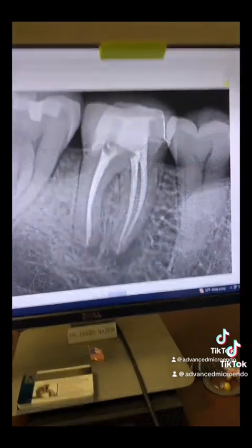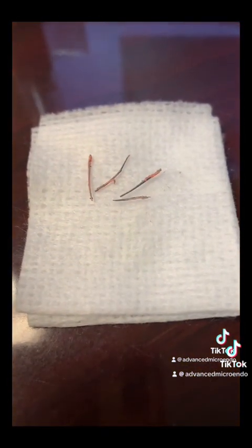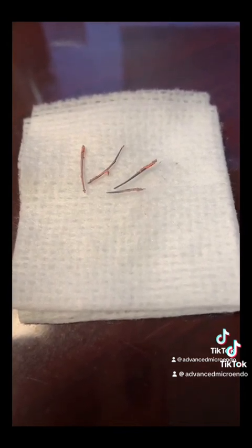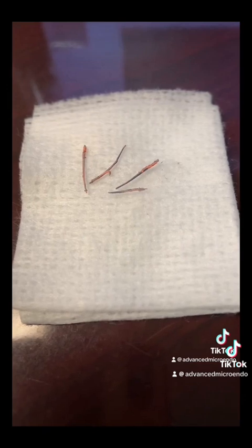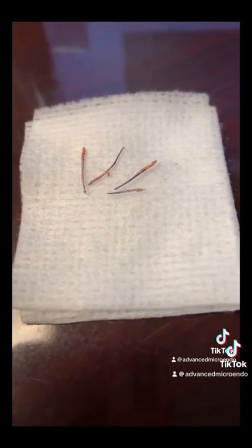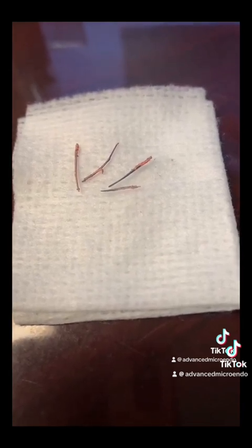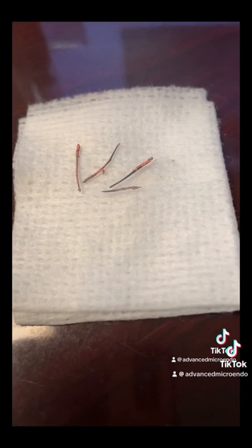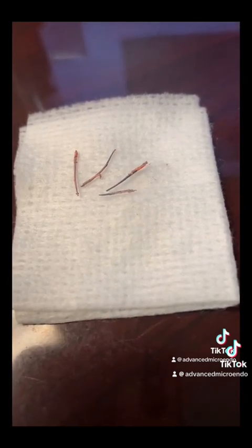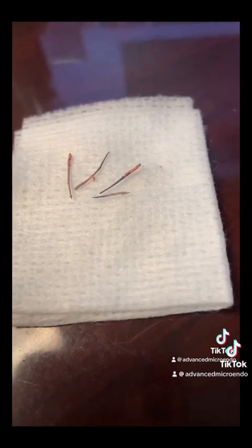were plastic thermofill carriers. I have a couple of videos that are all here, and also on my Instagram page, TikTok, and YouTube channel, where I teach you my technique for removing these. These four of them we removed, along with a fiber post.